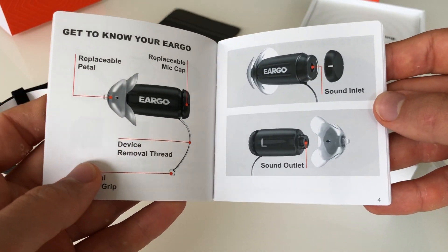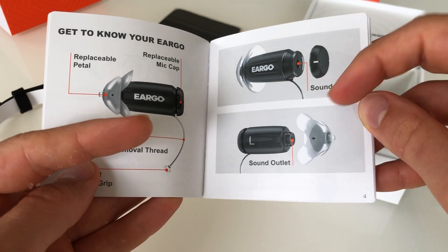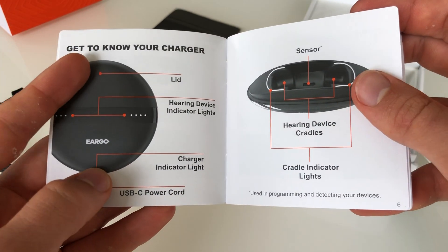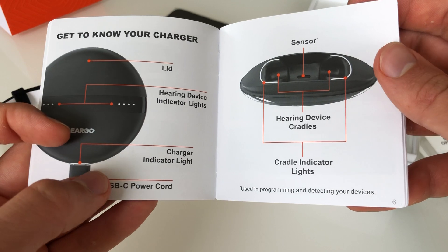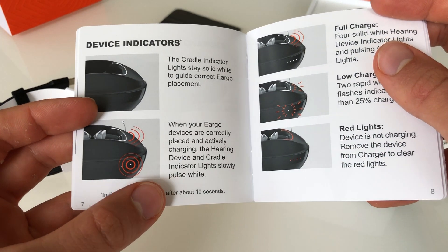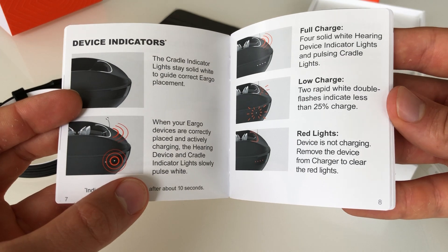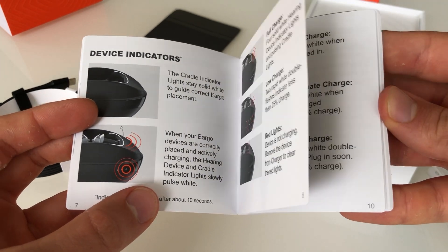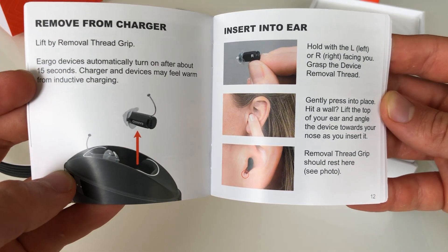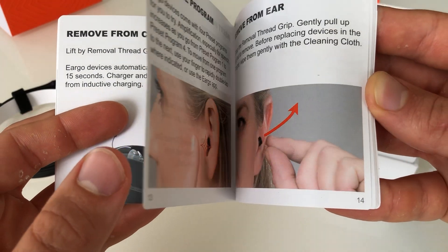This is a nice guide that walks you through the different pieces of the hearing aid, where sound comes in, where sound goes out. Getting to know the charger with the indicator lights and the power cord. This charger for this generation is new for Eargo, for the Eargo 5. You have some device indicators indicating full charge. How to insert it in your ear — you want that plastic line just on the outside of your ear canal at the bottom.